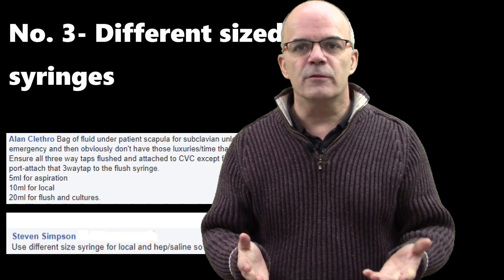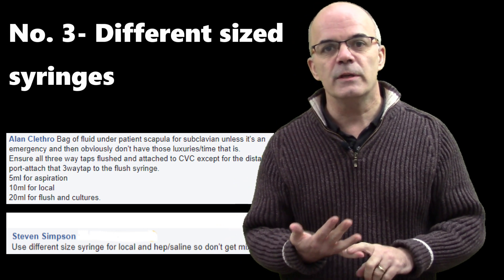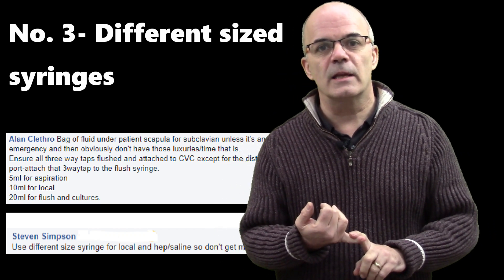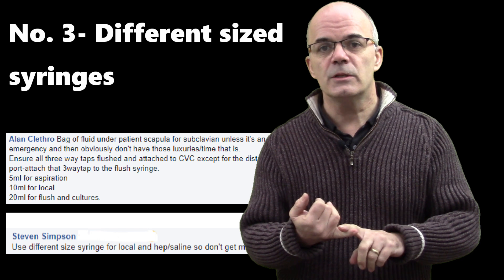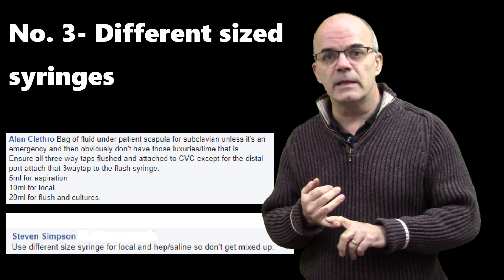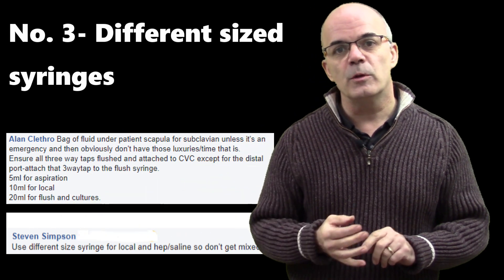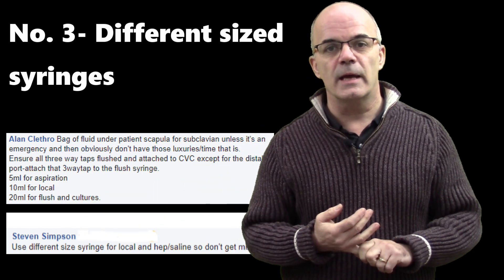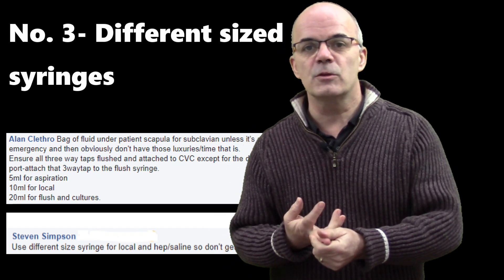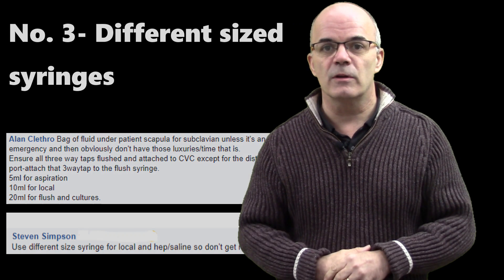Number three: different size syringes for the different processes you're going to take part in. You're going to have a 5ml syringe, a 10ml syringe, and a 20ml syringe. The 5ml syringe is for giving the local anaesthetic — and that's very important, you need to know which syringe has the local anaesthetic in it. Once you've finished with it, put it as far away from you as possible so you're not tempted to pick it up by mistake. The 10ml syringe will be full of saline to flush all the ports, and the 20ml syringe is for aspirating those ports and possibly taking blood cultures if required.